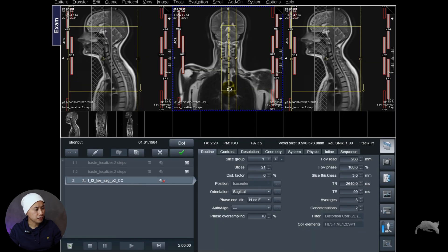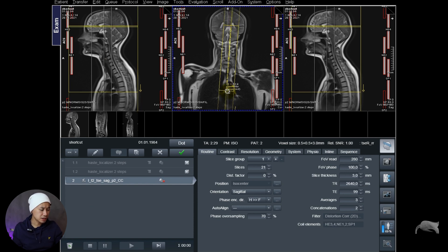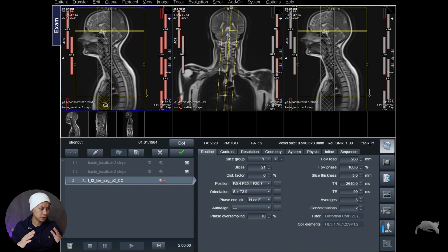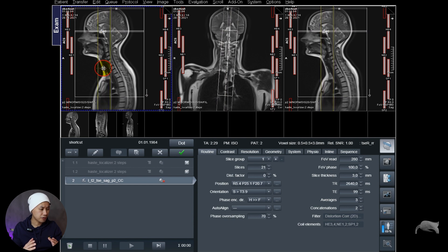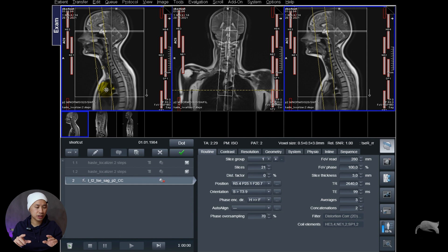In front of you here we only have a cervical spine — I'm just going to show you how you can position it much faster. Look at this: I can angulate and at the same time I can move the box. I don't need to find a midpoint to move it — I can angulate and move it. That's when I hold the Shift button down while pushing the left mouse button.